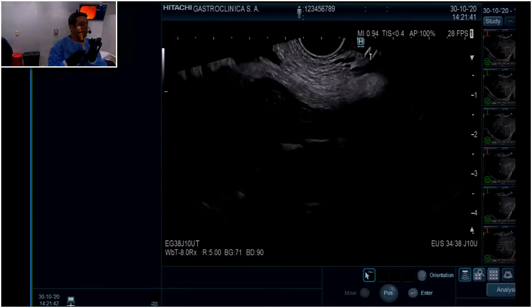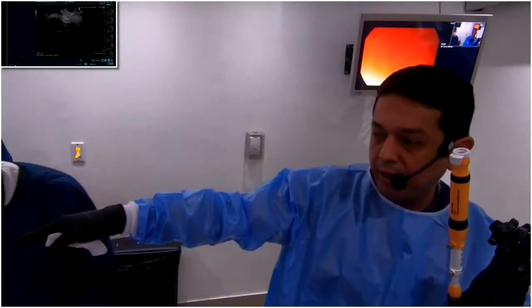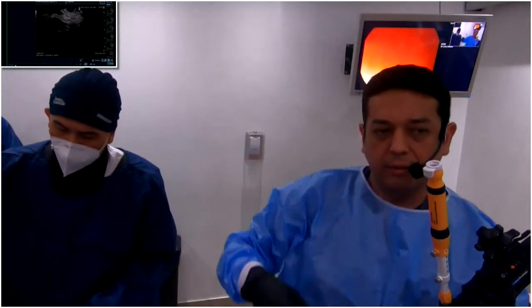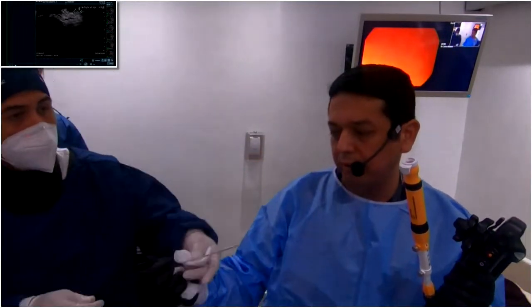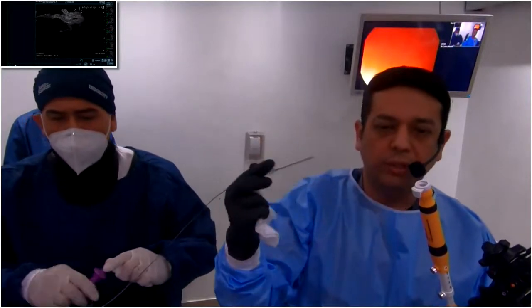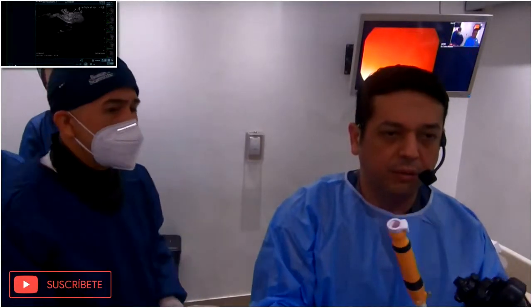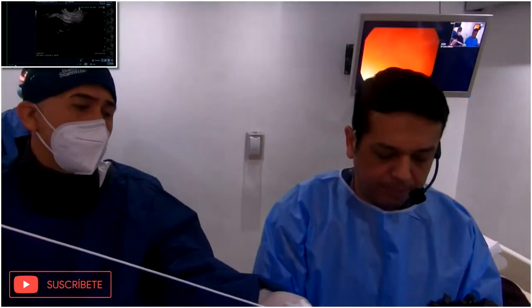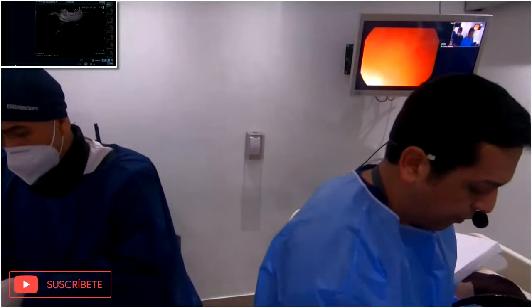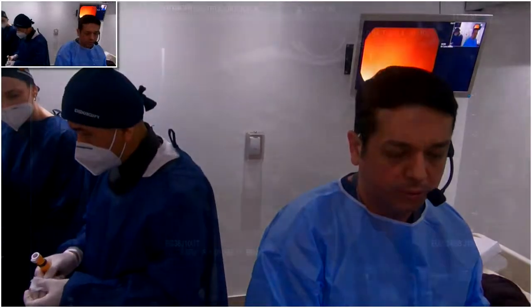Quiero ver la aguja. Aquí. No, no, la aguja. Eso, muy bien. So you can see here, my needle is there. ¿Podemos verla? And we can do a reinsertion of the needle, go inside. But not today. You just need to push here to put again the needle, and the needle goes inside. So I will take off everything. I think we finished now. A very nice case, I think, and I think the combination of Shear-Wave in the future with the needles will be fantastic for certain cases of liver disease that we have today. Show it. Thank you so much. Terminamos la demostración. Gracias.